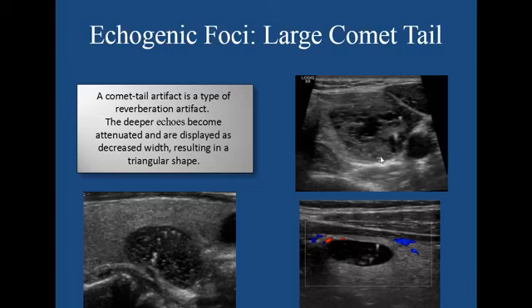And I think here we have spongiform, so we are dealing with a cystic nodule. Here we have a true cyst with this large comet-tail artifact. Also here we have a cystic structure with a large comet-tail artifact. So this large comet-tail artifact, we will see it with cystic nodules. We will not worry about it, and we will give it 0 points.